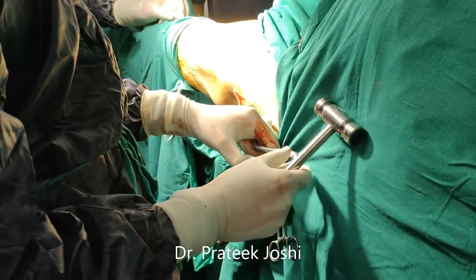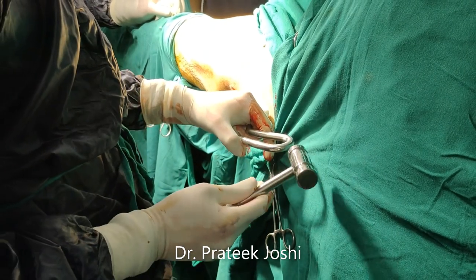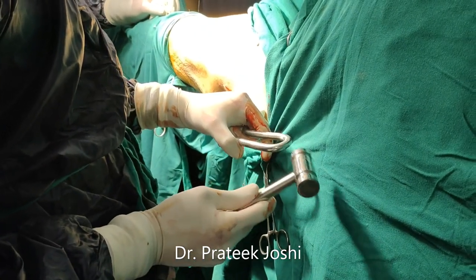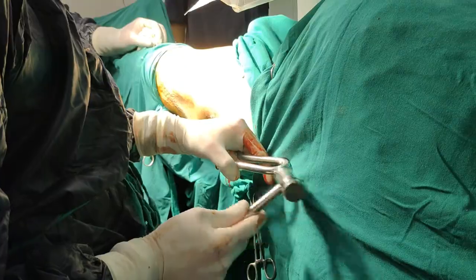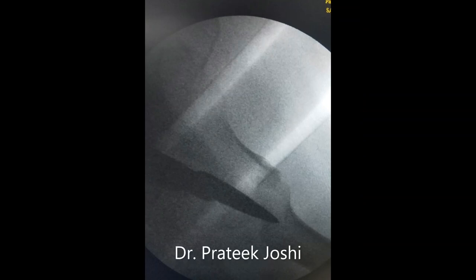Now we insert a curved awl just lateral to the tip of the greater trochanter in AP view and right in the center in the lateral view. And we advance the awl up to the level of lesser trochanter to open up the femoral canal.